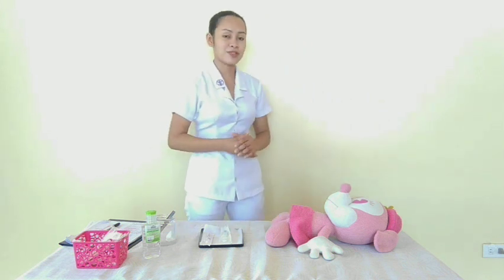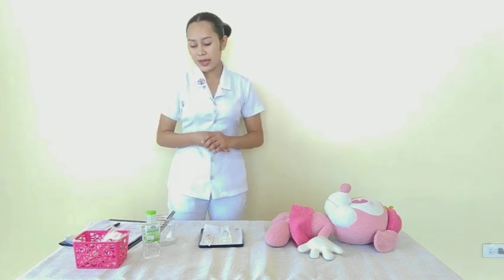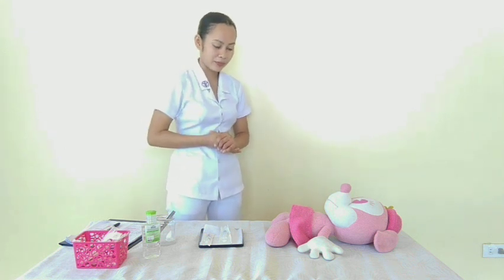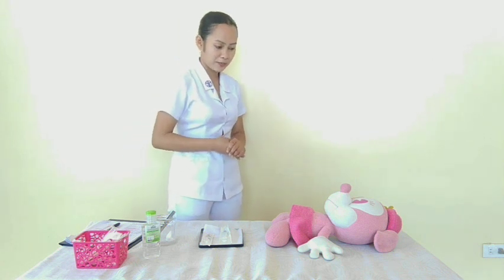Okay ma'am, so today I'll be administering your streptomycin. It is an antibiotic drug to help you cure your tuberculosis. And I'll be injecting this in your deltoid muscle, which is here. Okay, so do you have any further questions, ma'am, or clarification?